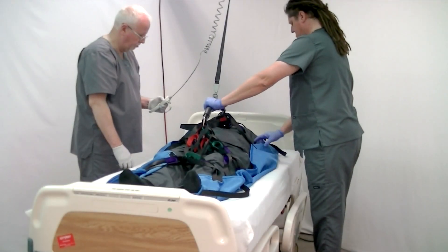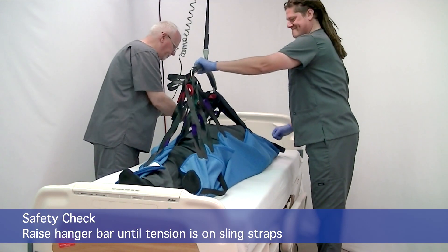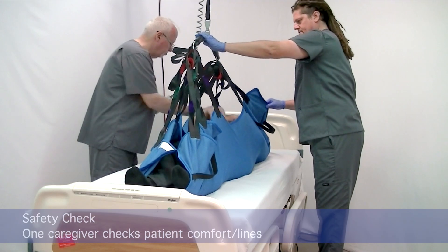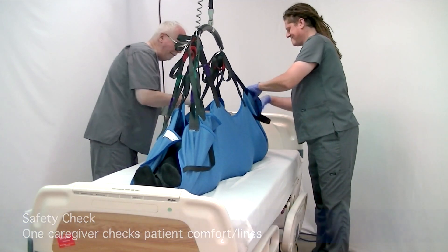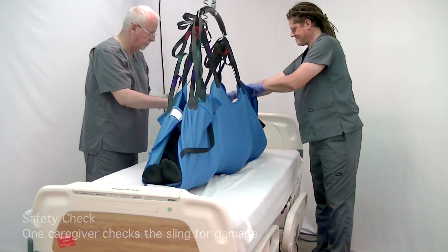Once the loops are secured to the hanger bar, we can raise the patient and do our safety check — we'll check the sling to make sure it's intact, and check the patient to make sure they're comfortable and their airway is good. If we're not sure or they're not comfortable, we're going to lower and adjust and add pillows for padding.